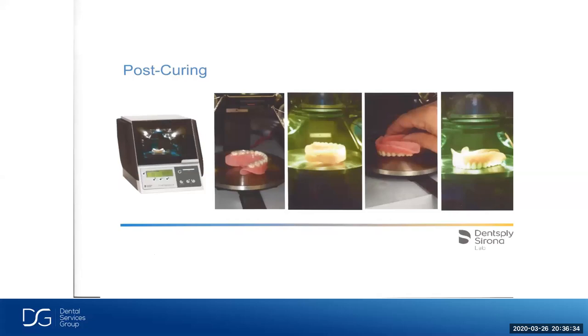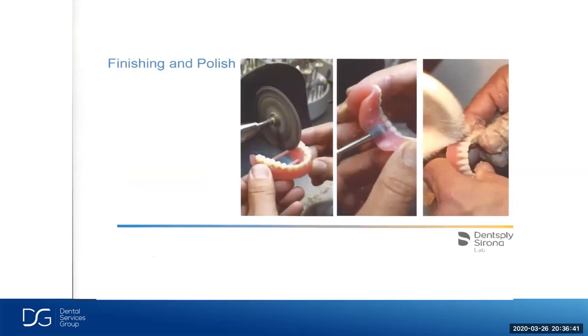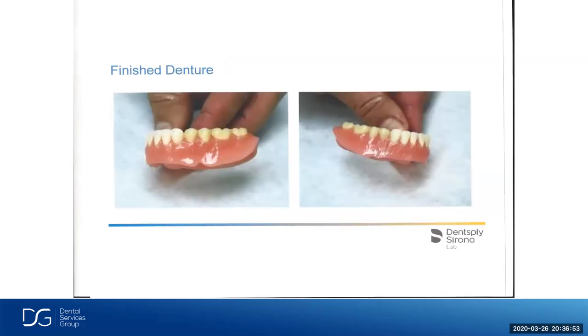And this is for about 25, 27 minutes. And once it comes out, we remove the supports. As you can see here, we use a disc. We grind off the rough spots there, and then we polish. So the denture is pretty much finished for us because we did all the contouring in the software. So there's not much work for us to do at all. And there's your finished denture.